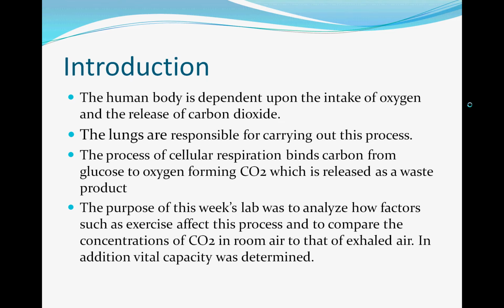The process of cellular respiration binds carbon from glucose to oxygen, forming carbon dioxide, which is released as a waste product of the electron transport system. The purpose of this week's lab is to analyze how factors such as exercise affect this process, and to compare the concentrations of carbon dioxide in room air to that of exhaled air. In addition, the vital capacity of the two subjects was determined and compared with the averages for the class.